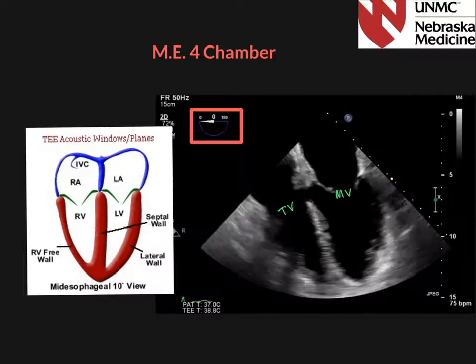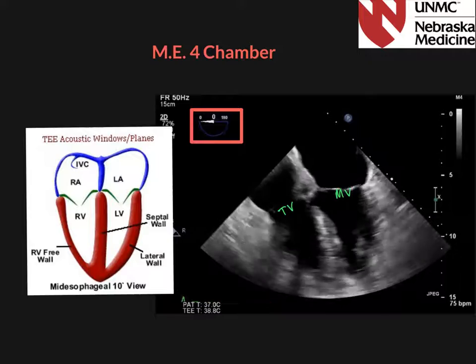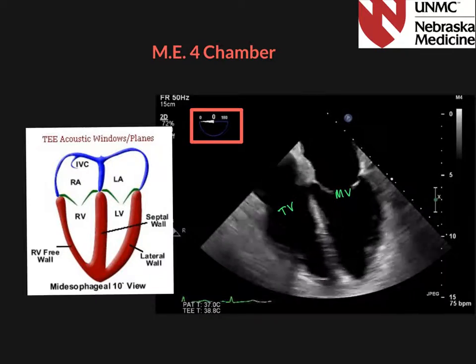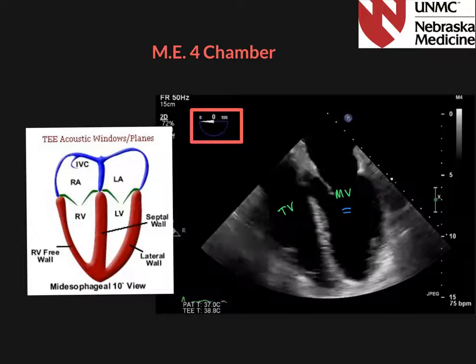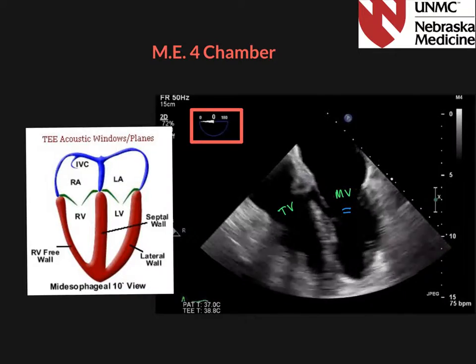We begin our diastolic evaluation in this view also by interrogating the mitral inflow to the LV. This involves placing pulse wave Doppler gate at the tip of the mitral leaflets during diastole. Interpretation of the resultant E and A waves that are obtained will help in quantifying the patient's diastolic function.